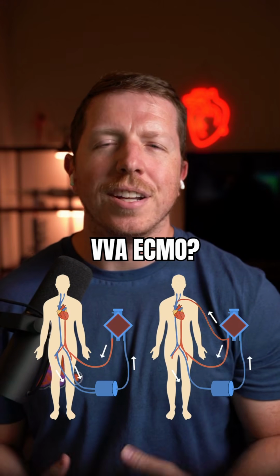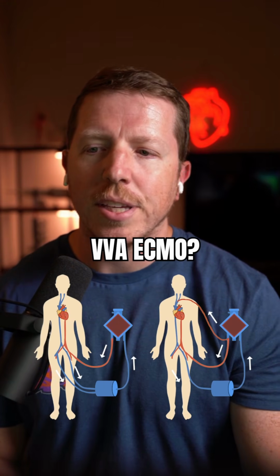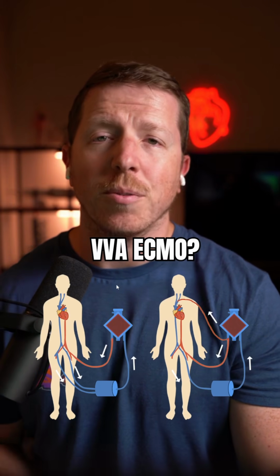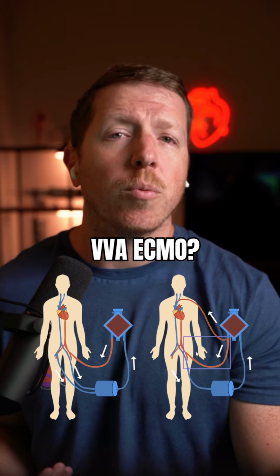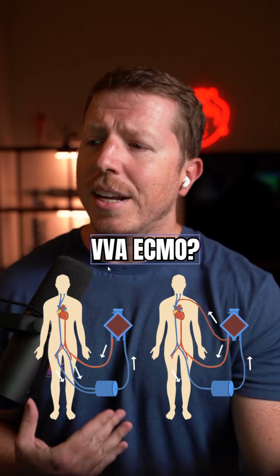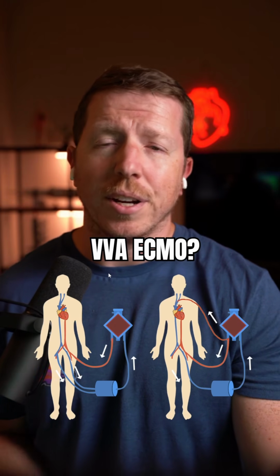So you get your report sheet and it shows that you have a patient who is on VVA ECMO. Now, just looking at it like this, does this mean that we have a patient with 2 venous drainage sites and 1 arterial return? Or do we have 1 venous drainage site and then an arterial and venous return? If we look at it like this, we can't really tell the difference between the 2 configurations on which one it actually is set up like.